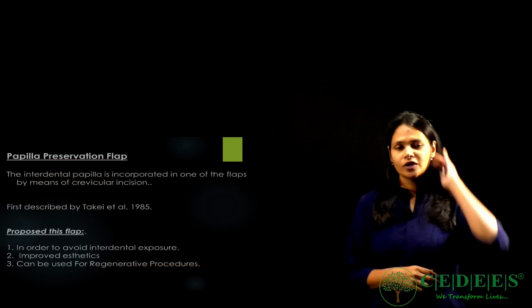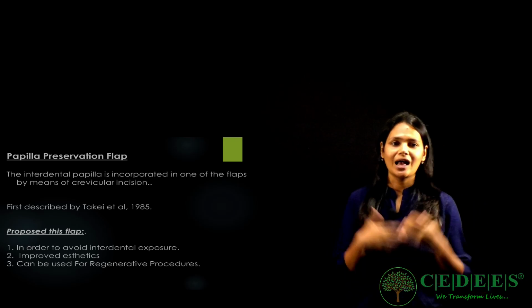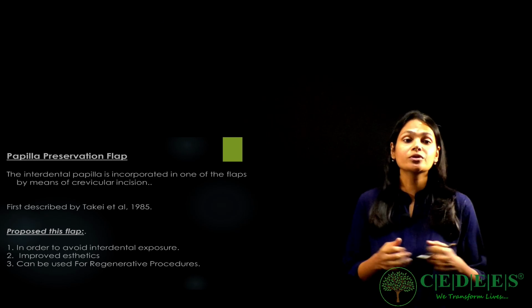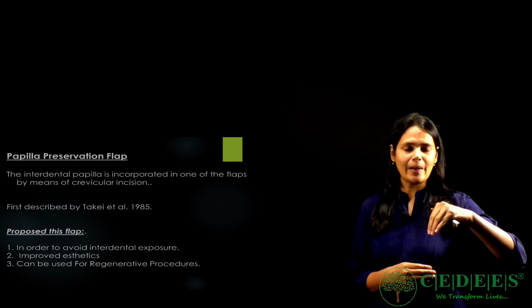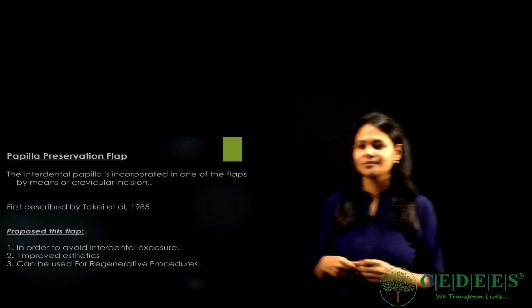Now let's come to one of the other flaps which is also commonly asked in exams, the papilla preservation flap. As the name suggests, in this you are supposed to preserve the papilla. You should not cut the papilla in the middle, but preserve it in one of the flaps. It can be either buccal or lingual.